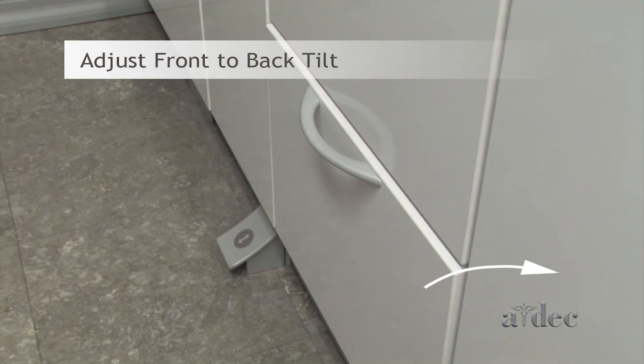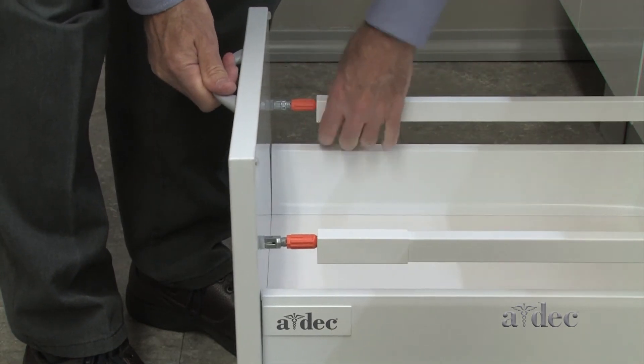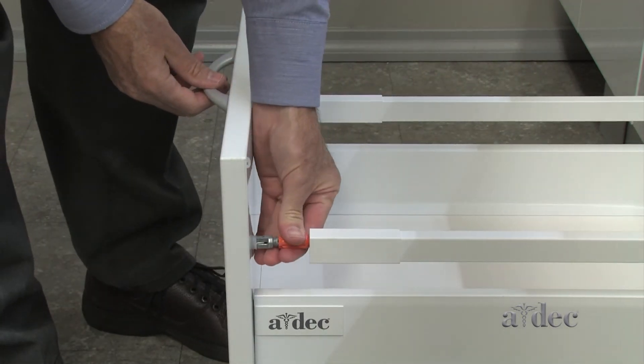To adjust the drawer face front to back, slide the covers and rotate the barrels.